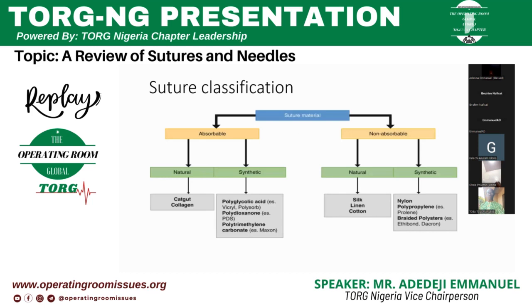So we have different classifications of sutures. We have the naturally occurring and we have the synthetic. The general classification is that some are absorbable and some are non-absorbable.